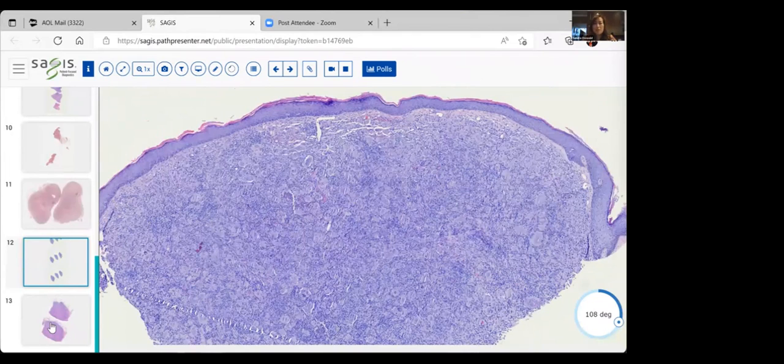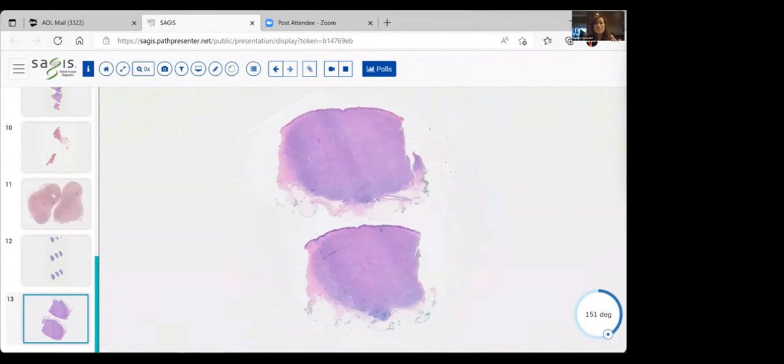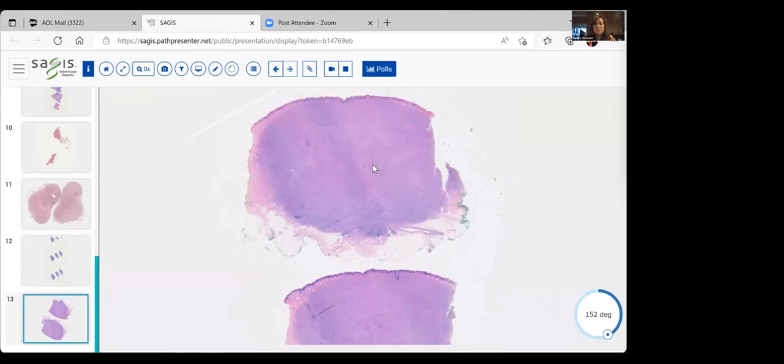And finally, we're going to end with this great example of a different large cell type. Now, this cell is not a histiocyte. Nope. This cell is of neural origin, at least that's what we believe. So let's look at this a little closer.